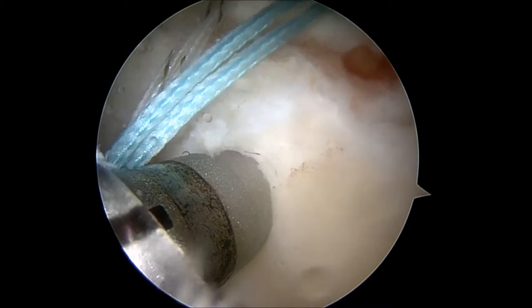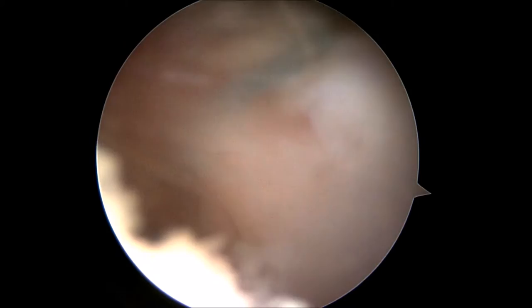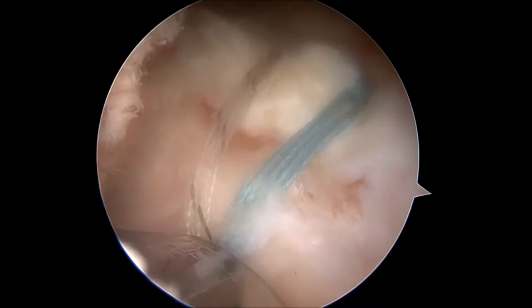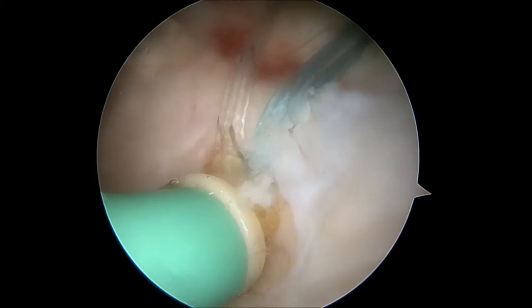Then the four suture limbs are secured on the edge of the bone using another screw-type device. As this device is screwed into the bone, the suture limbs are tensioned, applying compression onto the top of the rotator cuff tendon down to the underlying bone. Compressing the rotator cuff tendon in this manner provides increased stability to the repair and increases the likelihood for successful rotator cuff healing. Here you can see the tension in the sutures being applied and the screw-type device being inserted.